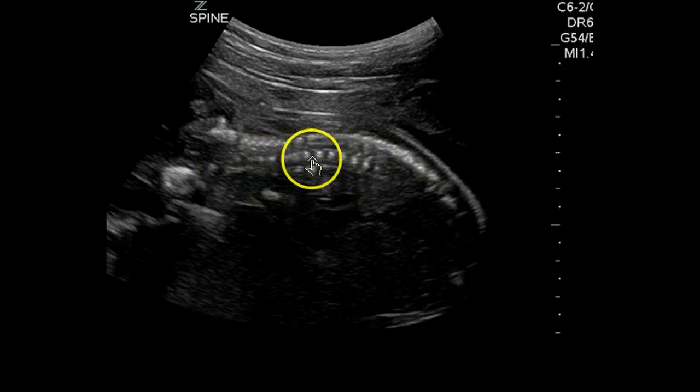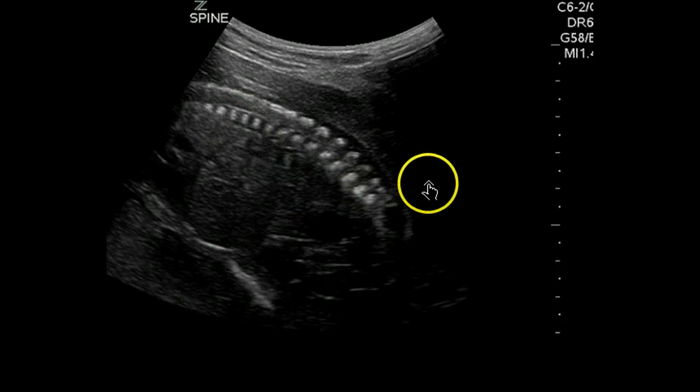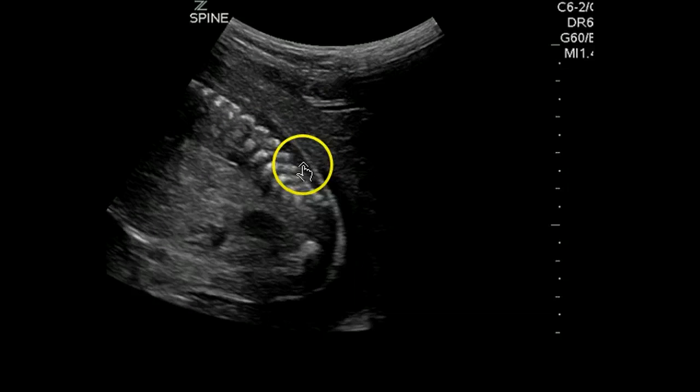Along here, this is where you can get tricked a little bit. You wonder, am I looking at vertebral abnormalities here? Why is this spacing kind of weird? I think that's just what you normally see, especially in this curving area. Really hard to pick up anomalies in this unless you're really looking for it. And on a general screen, you're not going to see that typically. Here, I like to see the sacral upturn with skin covering it.